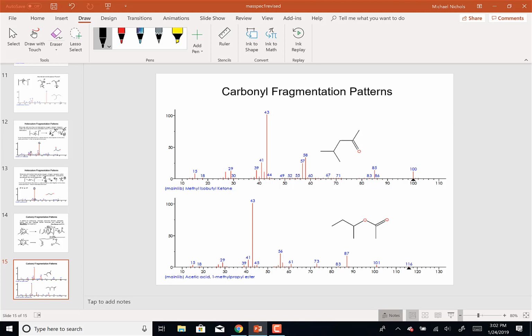Then I can impact it and determine what its fragments are. So in tandem mass spectrometry used for drug testing, you not only have to find the peak at that time with the same mass spectrum, but a fragment, or more than one fragment, has to produce the same mass spectrum as well. And then it's considered a positive. We could use that to try and figure out different structures.